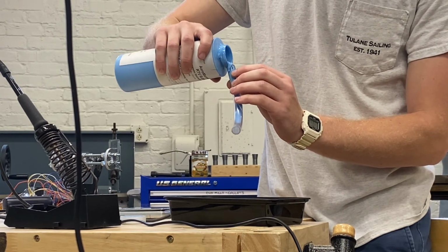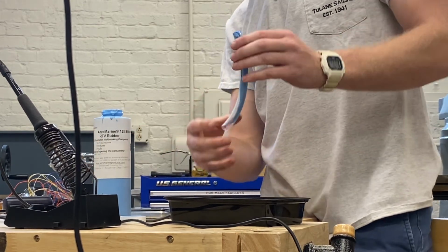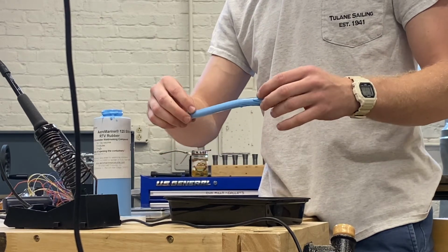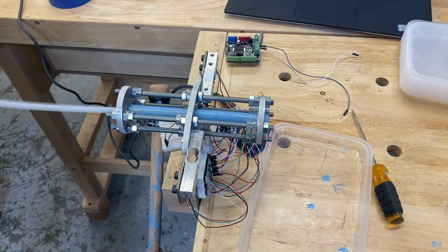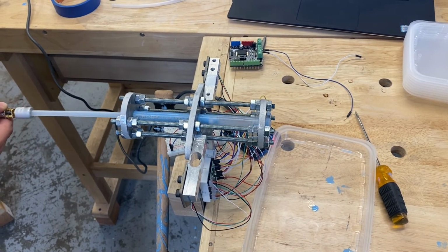The blue liquid silicone was poured into the tubes until it covered the entire length of tubing. The tubes were then held up so that any silicone not sticking to the edges would fall out. Finally, the tube was weighed once again to determine the filled weight. After being filled with silicone, the tubes were inserted into the testing rig.